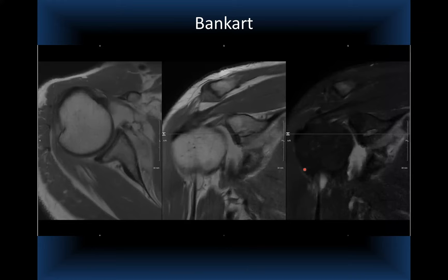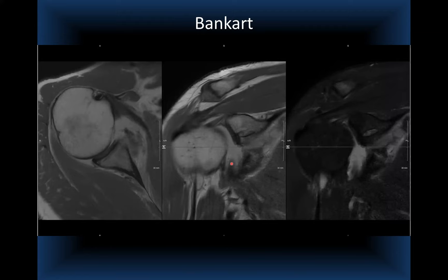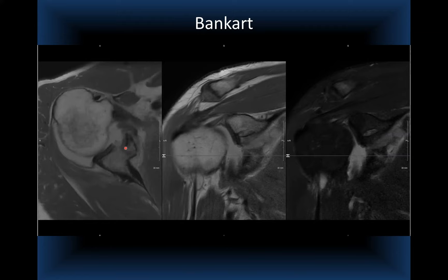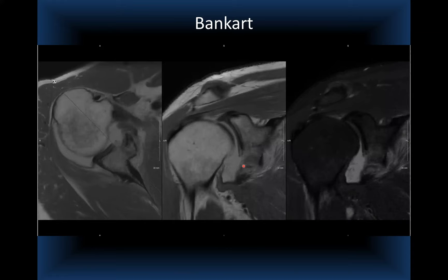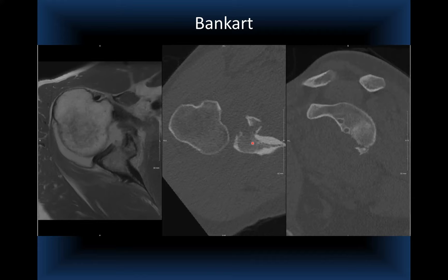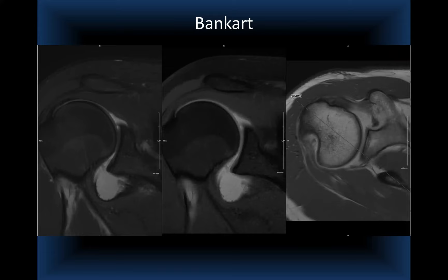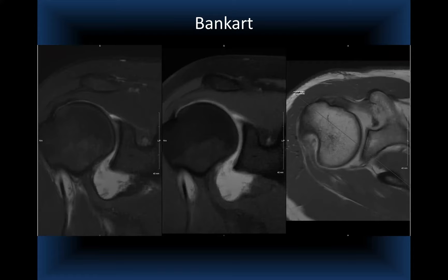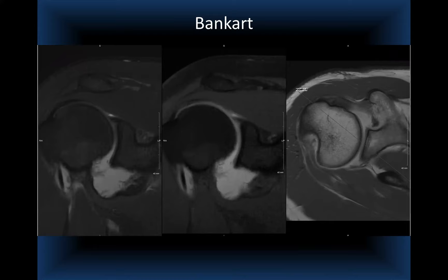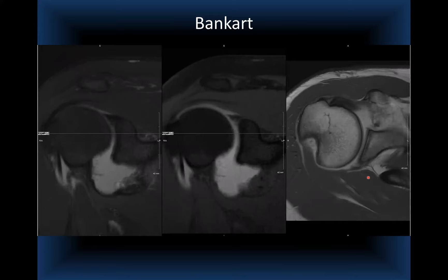Another case involves a patient who had a prior stabilization procedure — a Bankart repair — but dislocated again. A very large bony Bankart with a piece of bone and cartilage displaced from the glenoid is seen, along with suture anchors from the prior repair. The degree of comminution is greater than the previous case, and all these factors have prognostic implications.